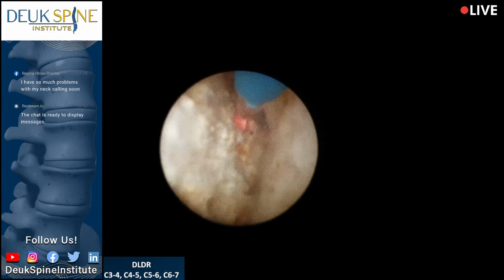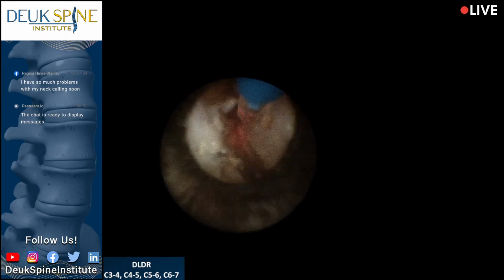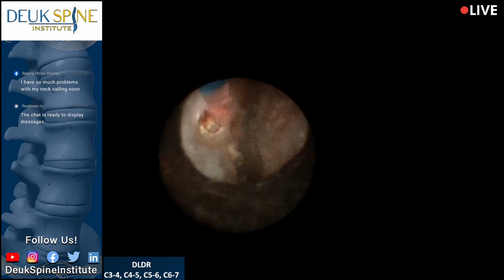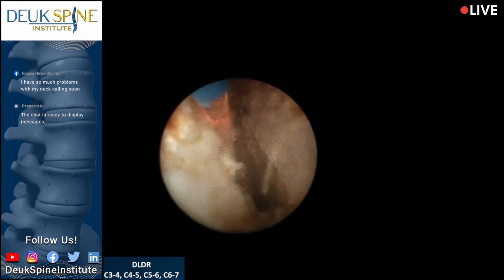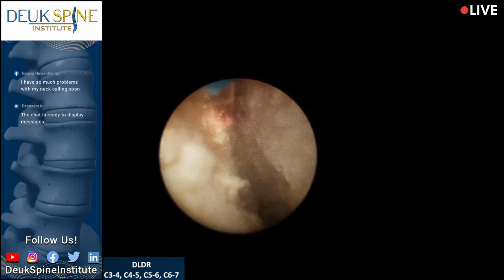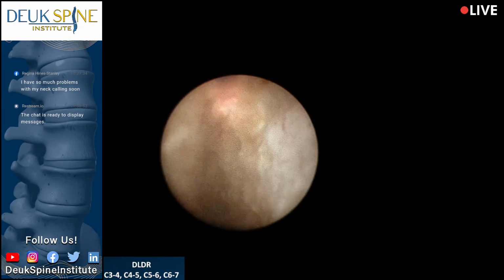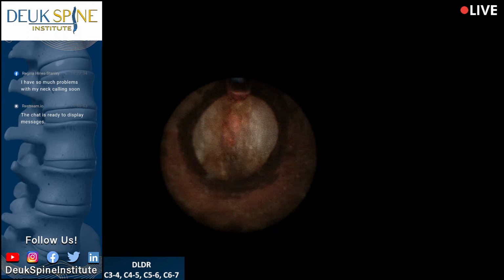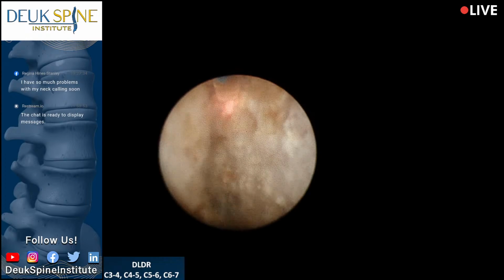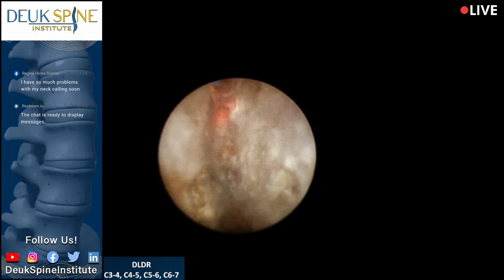From the amount of inflammation being so severe. They're definitely not fused, in case you're wondering. But you know, to do fusion in the spine or anywhere in the body between bones, you need inflammation, and he's got plenty of that. So the first step of fusion, he's got down. Really good. I think we're just about done here.